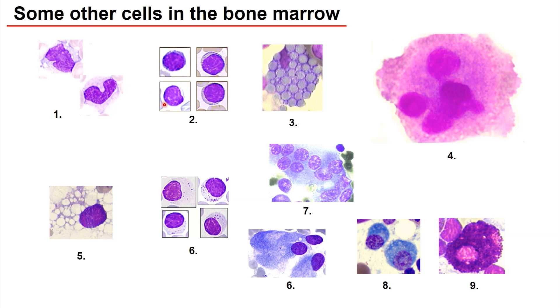The next batch of cells — labeled with two and six — are similar cells, except the first four at number two: they have about the same size as the red blood cells, the nucleus almost fills up the whole cell, with a very narrow and blue cytoplasm. While the other one is about double the size of the red blood cells and has a bigger cytoplasm with some tiny granules. These are lymphocytes — number two labeled as small lymphocyte and number six as large lymphocytes.